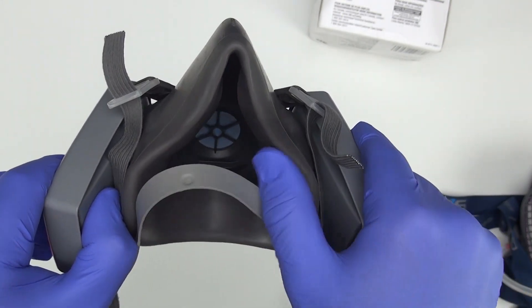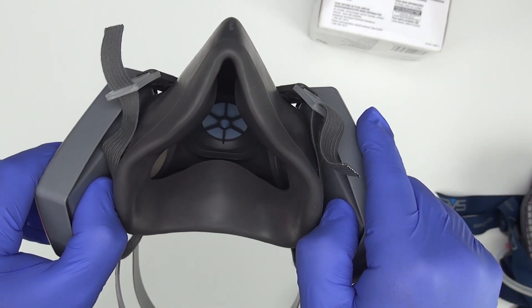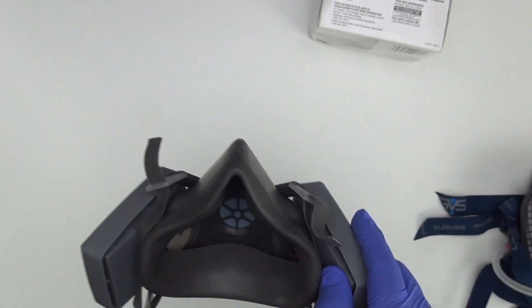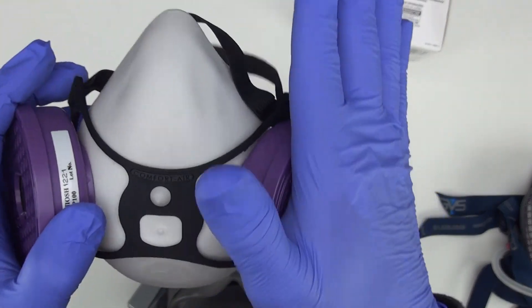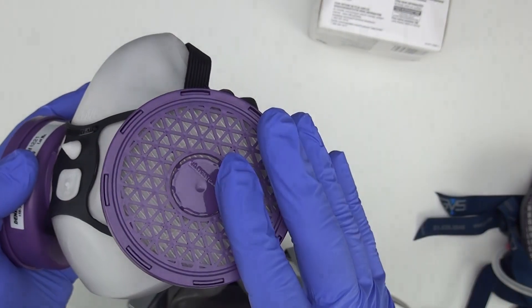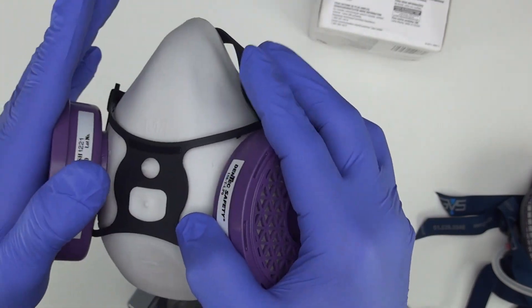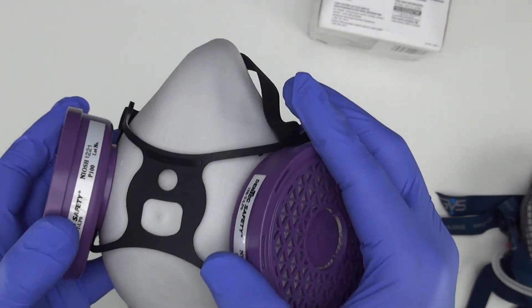And if you inhale and can't get any air through the seal of the mask, you know it's sealing well on you. You can do that with other masks. You can hold your hands over this Dentec, but it's hard to cover these big filters. You may need to put a piece of plastic over it to help you cover it for that negative pressure check.